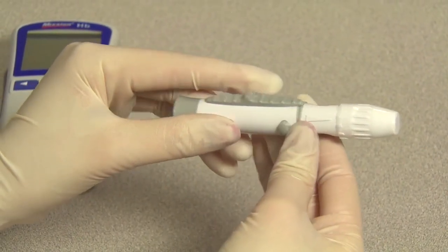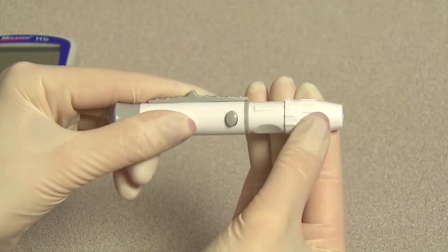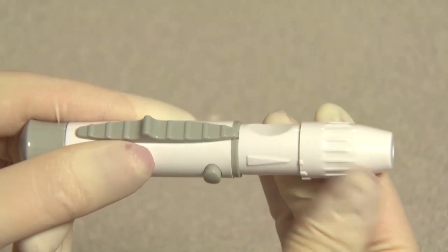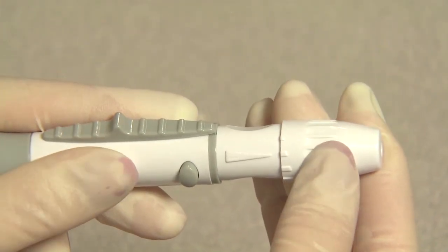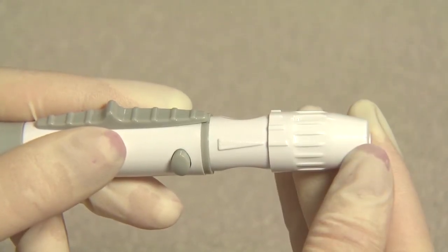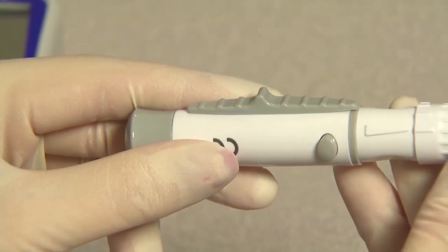Make sure the cover is fully seated on the lancing device. Adjust the puncture depth by rotating the lancing device cover. There are a total of six puncture depth settings. To reduce discomfort, use the lowest setting that still produces an adequate drop of blood. Use settings 1 and 2 for delicate skin, 3 and 4 for normal skin, or 5 and 6 for calloused or thick skin. Pull the cocking barrel back to set the lancing device. A click may be heard. The device is now loaded and ready to obtain a drop of blood.